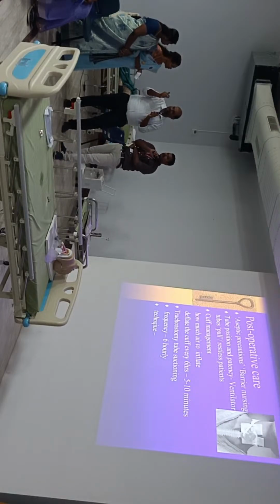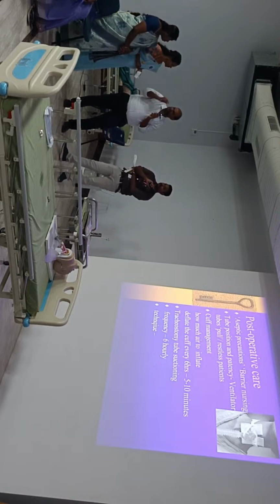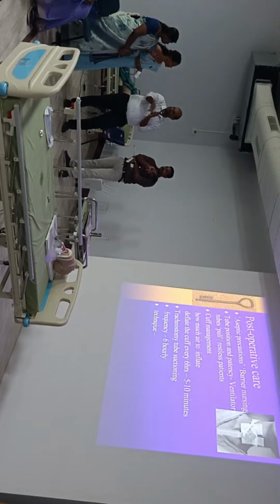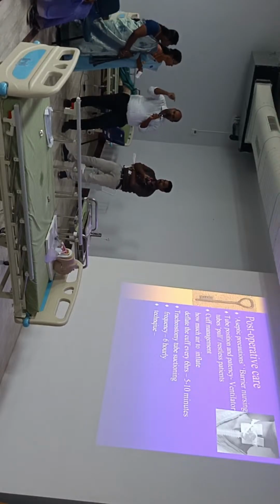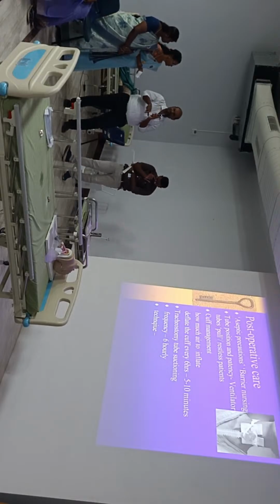So the end of the suction catheter, if you see, is not smooth. It will be a bevel edge, like a syringe. Is this a procedure done under vision or a blind procedure? It's a blind procedure. You are not sure how much you are inserting. So what will happen? You insert it repeatedly and the injury occurs at the same point.